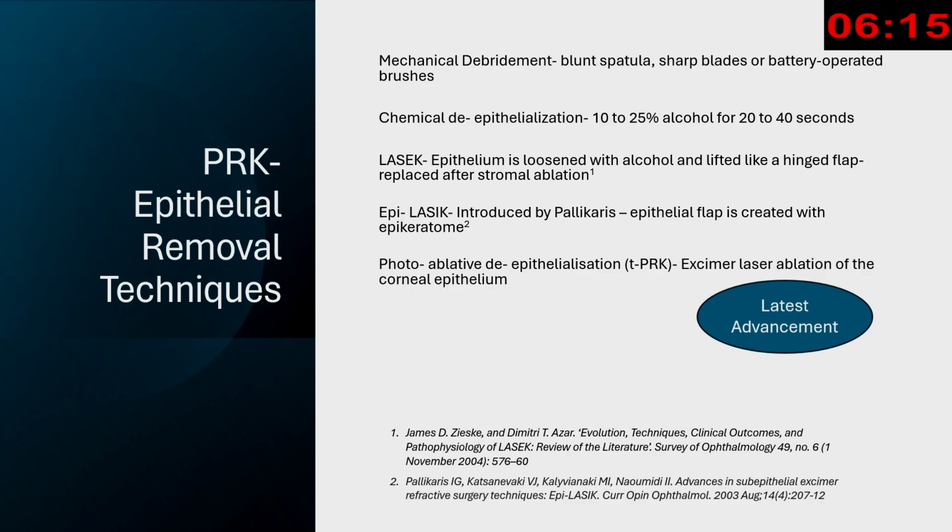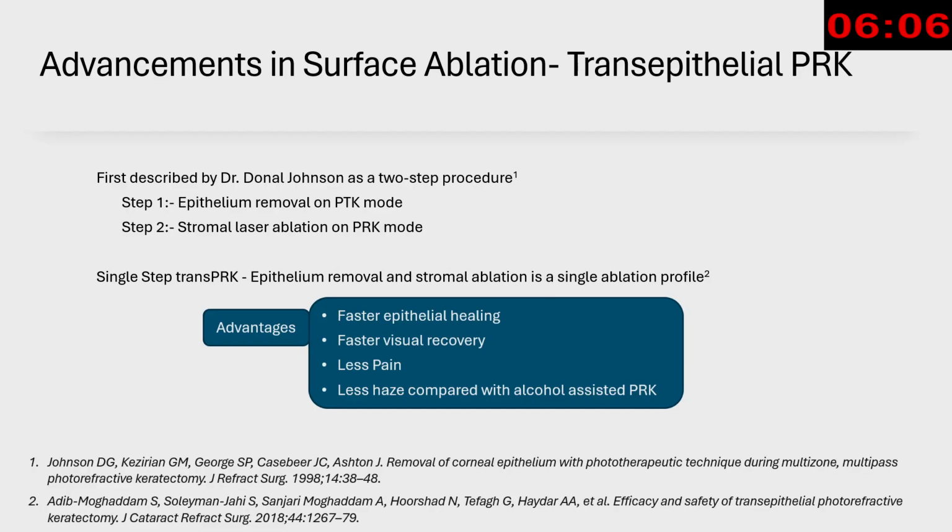However, the latest advancement in surface ablation is transepithelial PRK, which is a photoablative deepithelization where Excimer laser is used for ablation of corneal epithelium. This transepithelial PRK was first described by Dr. Donald Johnson as a two-step procedure, where in the first step, epithelium was removed on PTK mode, and in step 2, stromal laser ablation was done on PRK mode.